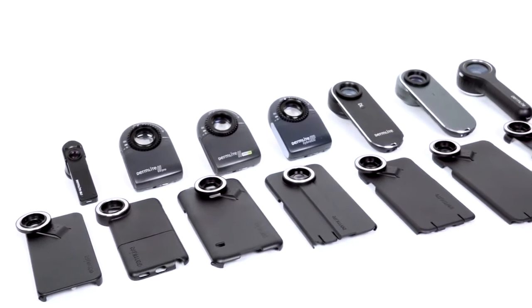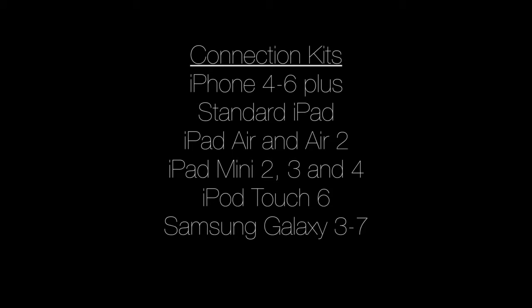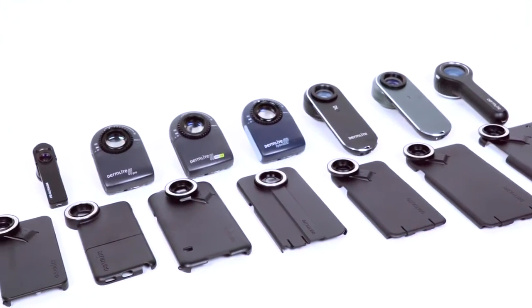All DermLight dermatoscopes are compatible with a wide variety of smartphones and tablets from both Apple and Android. It's important to note that all DermLight dermatoscopes are compatible with any of the connection kits.